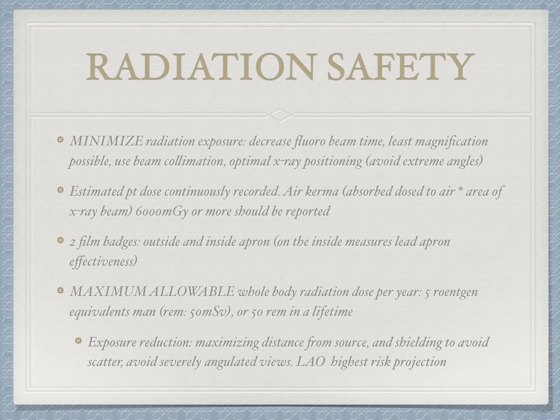What about radiation safety? You have to minimize radiation exposure by decreasing fluoroscopic beam time, using the least magnification possible, using beam collimators, and optimal X-ray positioning, avoiding extreme angles. For example, the LAO is the highest risk projection.